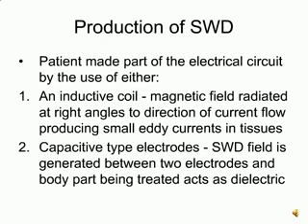There are two ways of applying shortwave diathermy, both of which are dependent upon making the patient an integral part of the electrical circuit. An inductive method involves the flow of electromagnetic energy through a coil. A magnetic field is set up at right angles to the coil, and it is this that creates small electrical currents in the tissues. In the past, this method involved wrapping the limb in an inductive coil, but more modern methods use a coil within a drum, which is applied at right angles to the tissues.